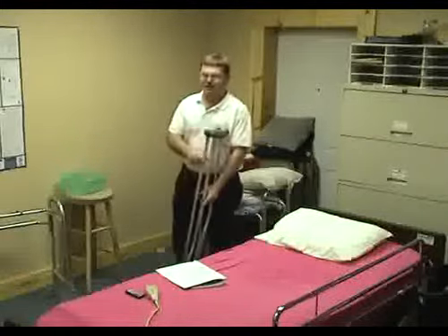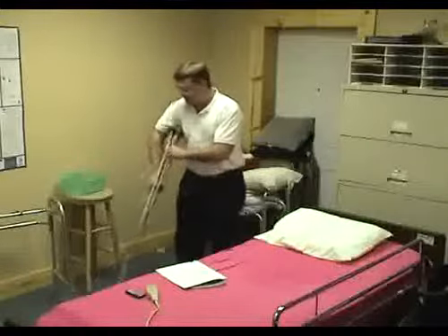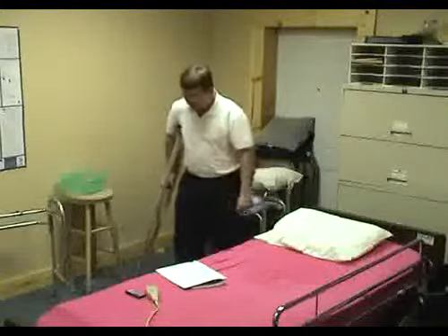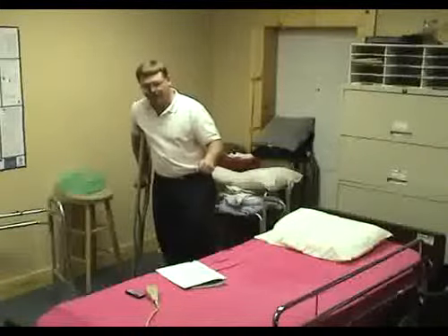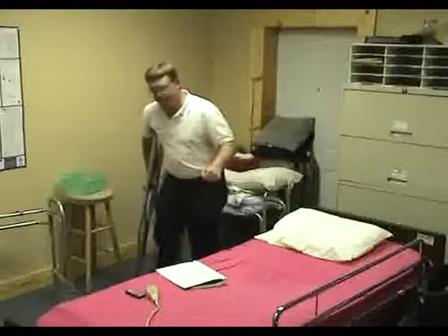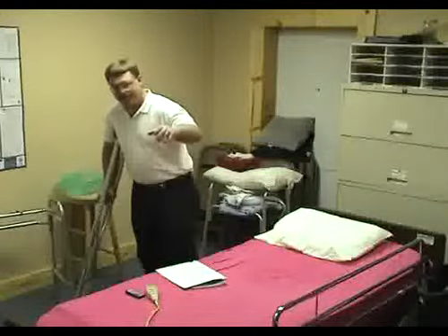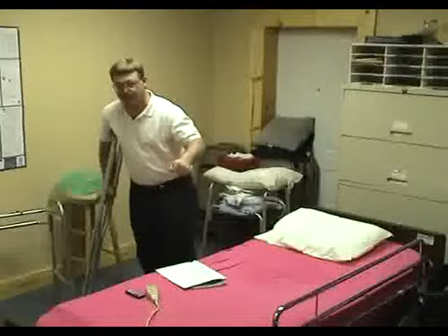Okay, again, my left leg is the bum leg. I'm going up some steps. Hopefully you're here to help me because I'll give you one of these to carry. If not, normally they'll put 2 of them in one hand, like this, holding on to the stair rail. Up with the good, down with the bad. This foot would go up by itself, and then I would bring this and my handrail at the same time. That's how you would go up with the good.